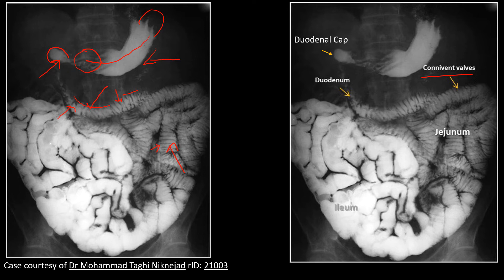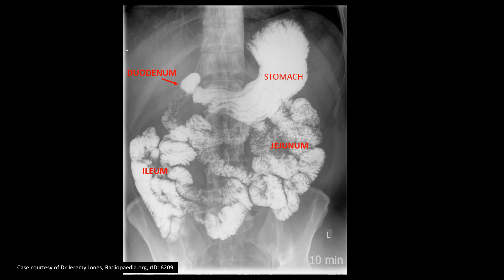The terminal part of the ileum is comparatively without such mucosal folds and does not show such plicae circulares. In this image, we can again see the shadow of the stomach, the pyloric part, the duodenal cap, the second part of the duodenum, and the third part of the duodenum with plicae circulares. Here is the duodenojejunal flexure, this is the loop of the jejunum, and this is the ileum.